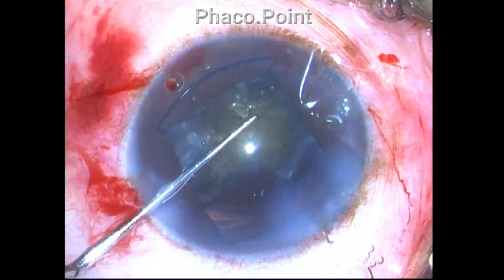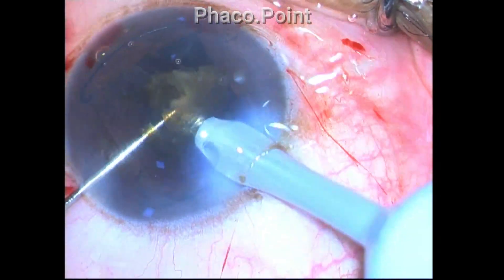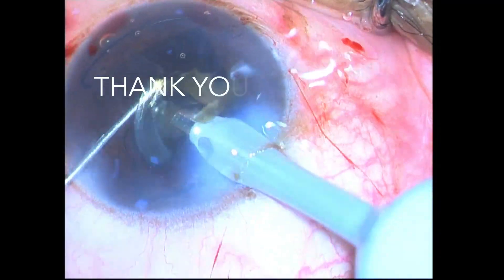I hope this tutorial on the hold, depth, angle of attack, and place of impalement of the tip has helped you and will change the way you perform the direct phaco chop. Thank you all for your attention.